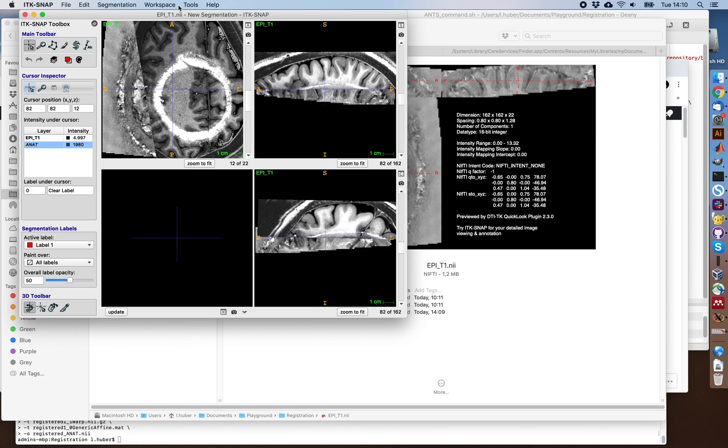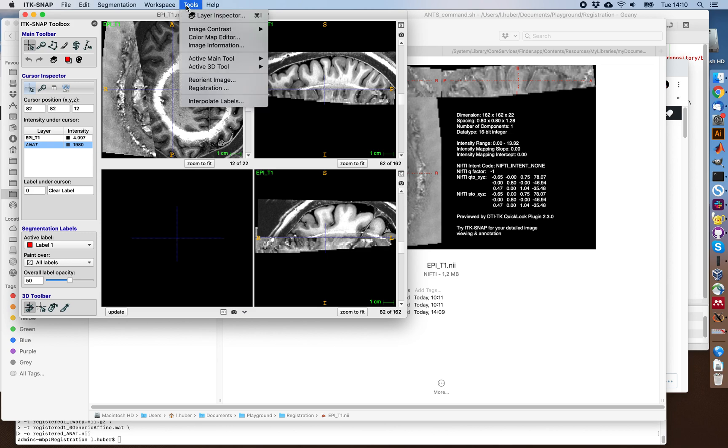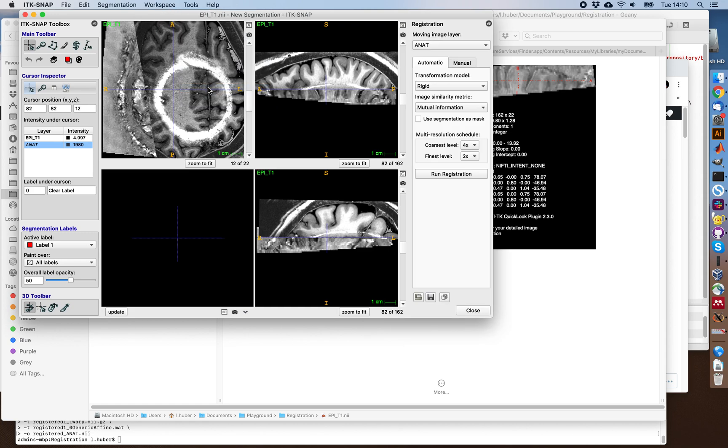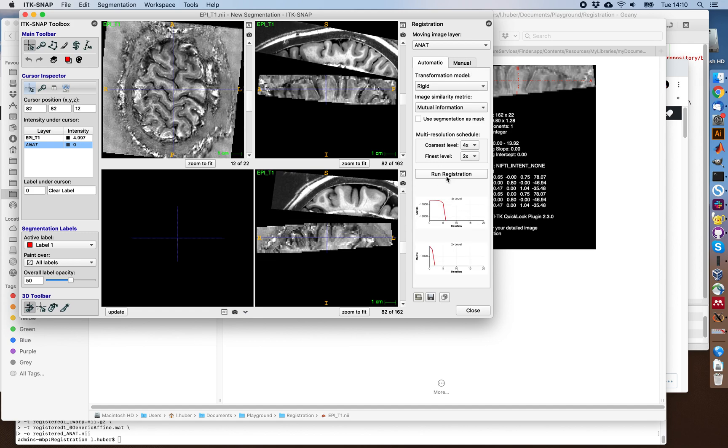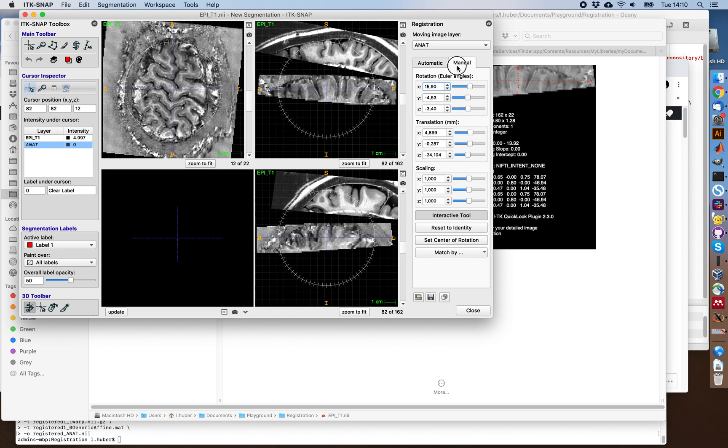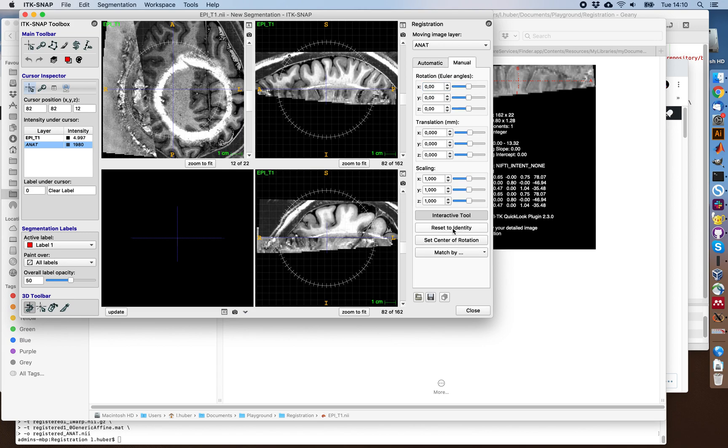And in ITK-SNAP, you have this manual and automatic registration tool. So when you go to tools here and hit registration, you have an automatic and a manual tab. For example, if we run the registration like this, you can see that it rarely works, especially not with these very high resolution slab data. So let's reset this to identity and use the manual tab here.